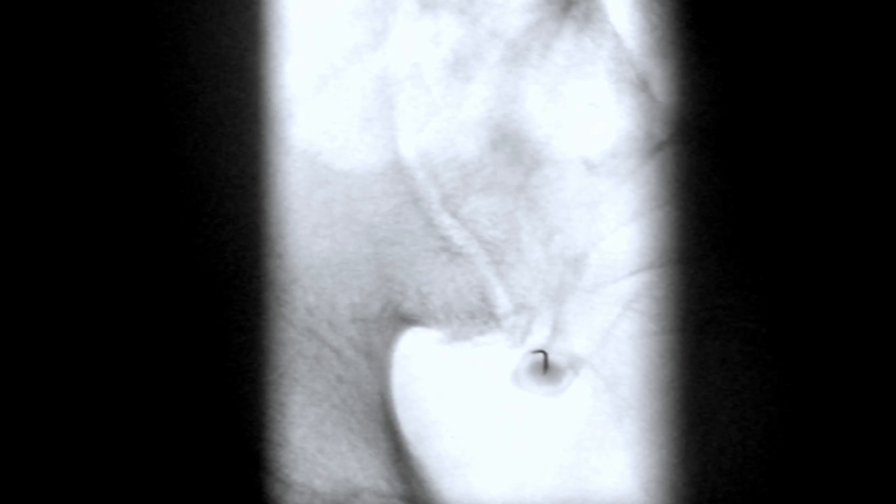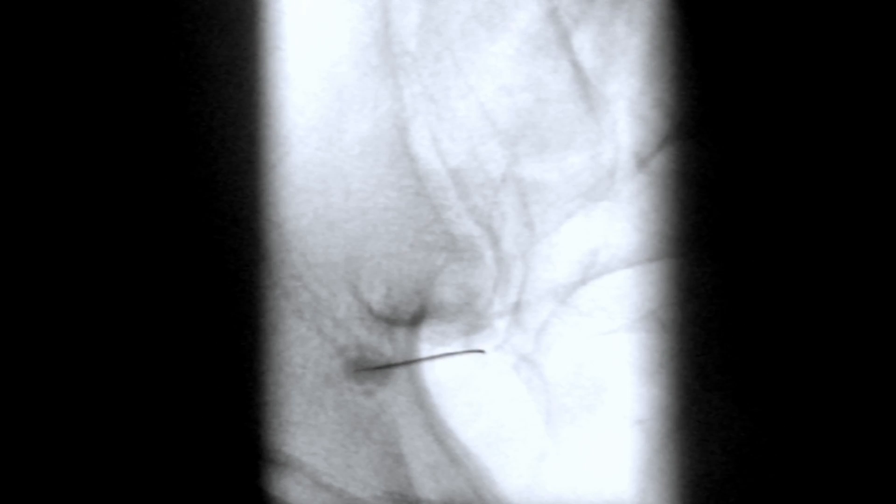Unfortunately, although the sacroiliac joint is large, it cannot be easy to enter due to its complex nature and variations in individual anatomy. Nevertheless, in clinical practice, I have observed that the inferior recess approach has the highest success rate compared to lower one-third targeting or other approaches in the sacroiliac intra-articular injection techniques.